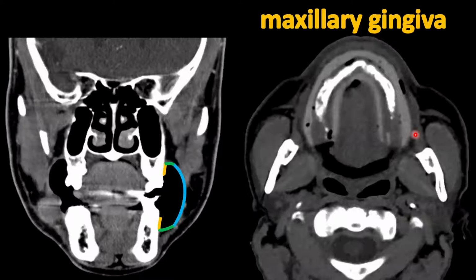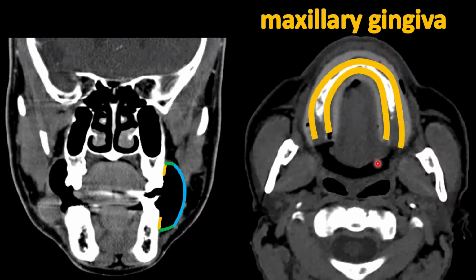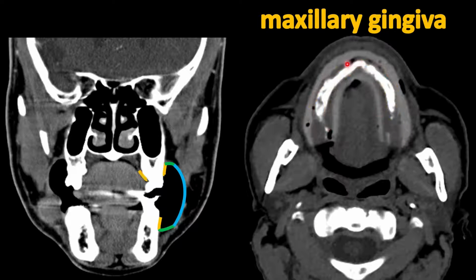So let's look at more of some of our mucosal aspects. So we have our puffed cheek here. Now this patient, they don't have food in their mouth or a comestible. What you're looking at here is this is actually the patient's dentures in here. And with the dentures left in, you can see how you very nicely delineate where the mucosal surface is of the maxillary gingiva. This is the maxillary gingiva, the mucosa overlying the alveolar portion of the maxilla.